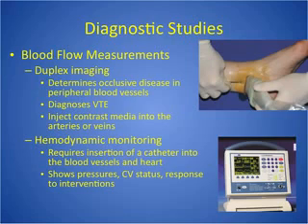And then lastly, hemodynamic monitoring. This will be talked about in great detail in critical care for cardiac, but just so you know in general what it is, as you see here, a picture of just a monitor. And this monitor is connected to a catheter that is inserted into usually the vessels of the neck and then threaded into the heart.